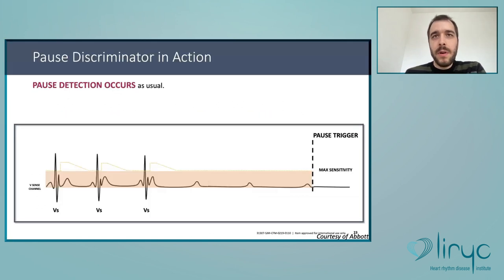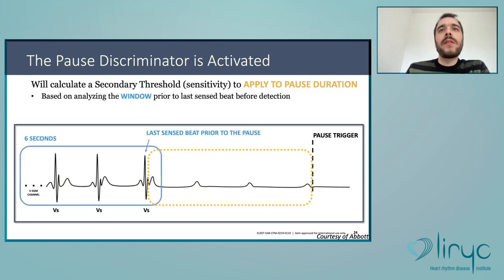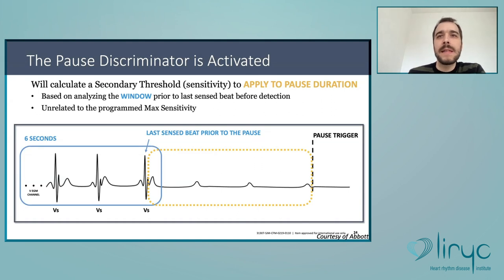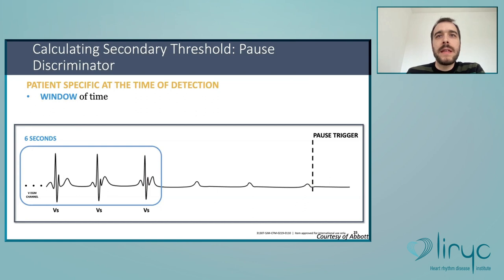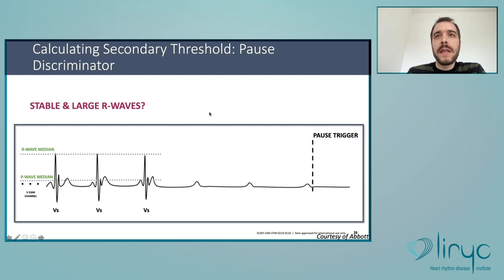So let's look at this example. Here you have the pause detection that occurs as usual, and you have the maximum sensitivity depicted in orange. The pause discriminator is activated and will calculate a secondary threshold to apply on the pause duration. This secondary threshold will be based on the analyzing window prior to the last sense beat before the detection, and it is unrelated to the programmed max sensitivity. It will then calculate the peak and the variability of the P and R wave over a certain window of time. And then through this window, it will calculate a secondary threshold for sensitivity, and it will look for undersense beats.